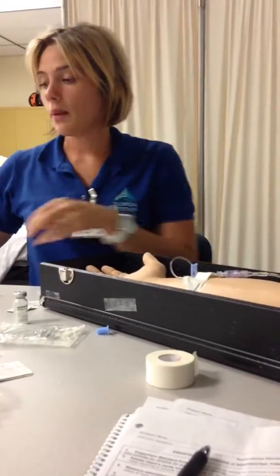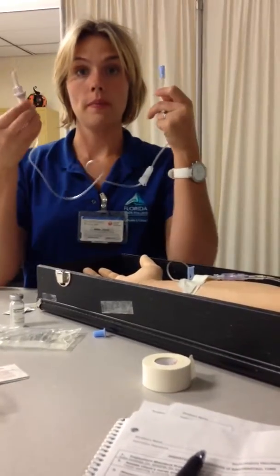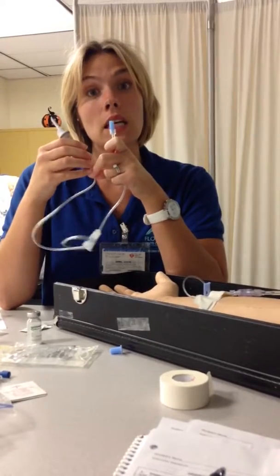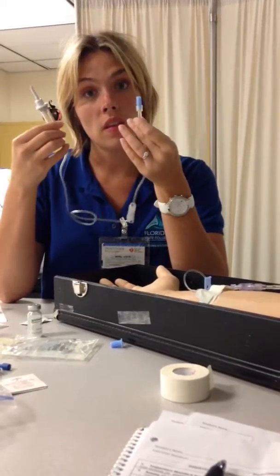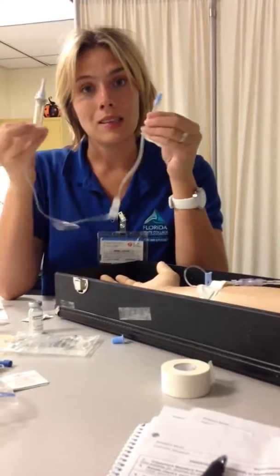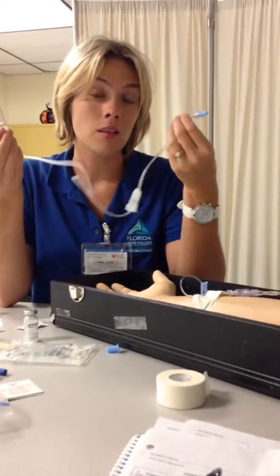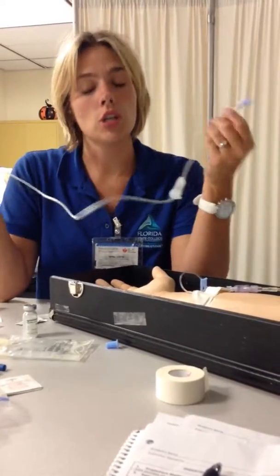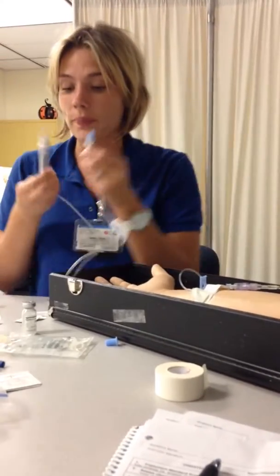I'm going to take my tubing. This is a secondary tubing. I'm going to label this, put my name and my date on it. And once I'm done with this, which I'll show later in the video, I'm going to put an alligator clamp on it, because these can be used again. Let's say this patient needs another medication, this can be used again so the patient's not charged again for the same device.